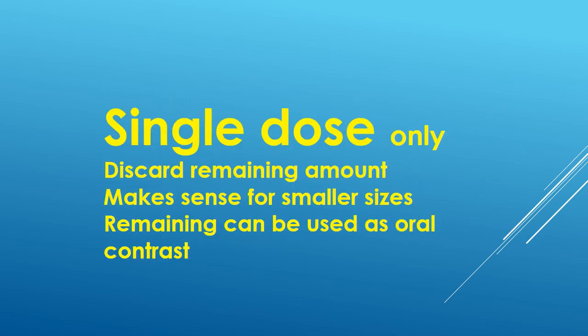So here, the solution is single dose only. When you open a bottle of contrast media, you use it only for a single patient. And then whatever is left, maybe 5 ml, 10 ml, whatever, you throw in the dustbin. It's small, because contrast media in the third world country is going to be a little costly for the patient, and then we are always looking forward to saving some money.